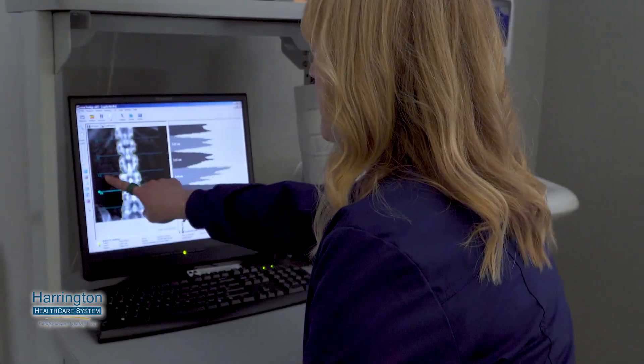We measure very specific areas. It's always the lumbar spine — L1, L2, L3, L4 — and then both of the hips.